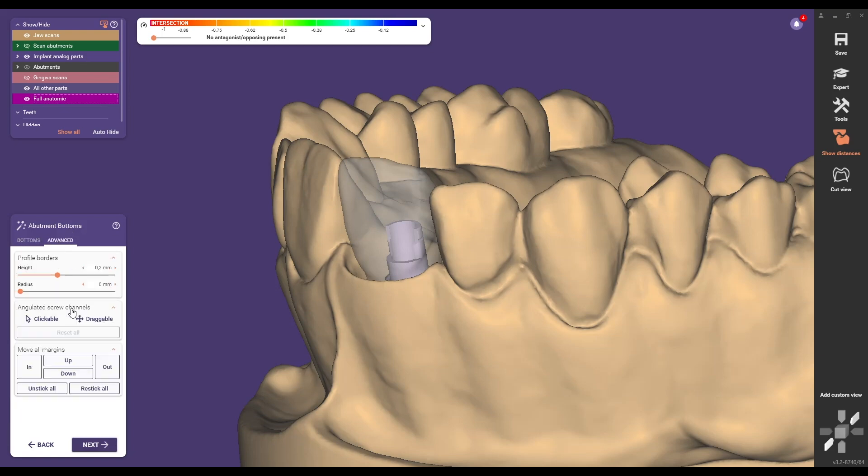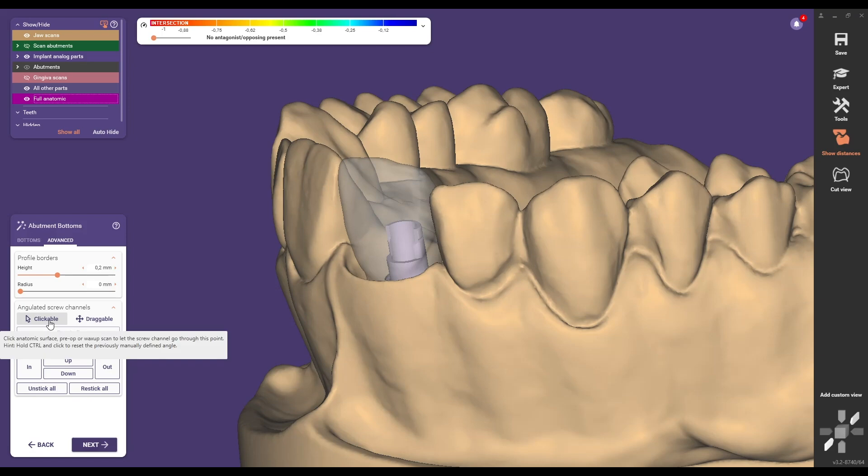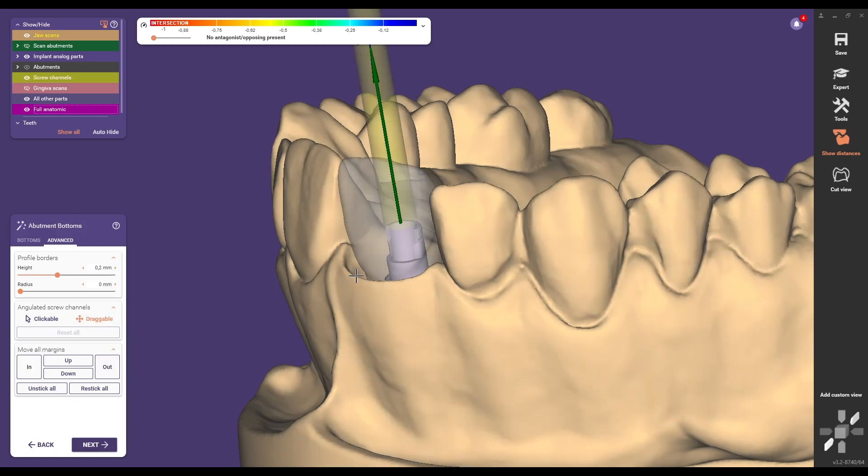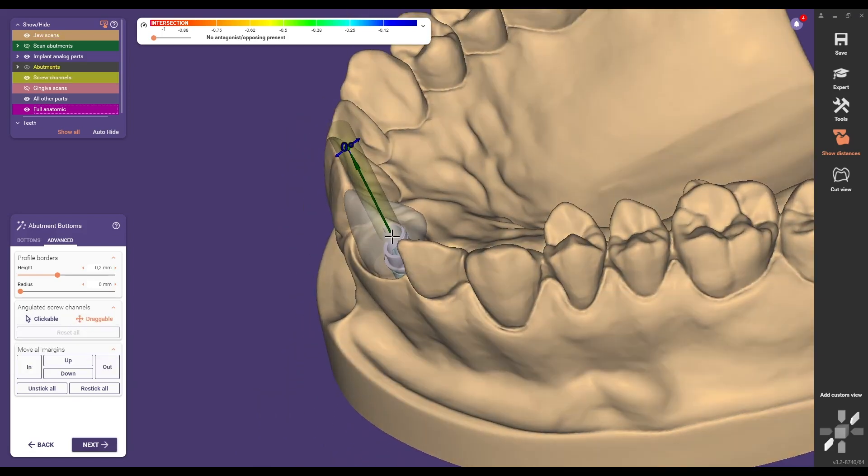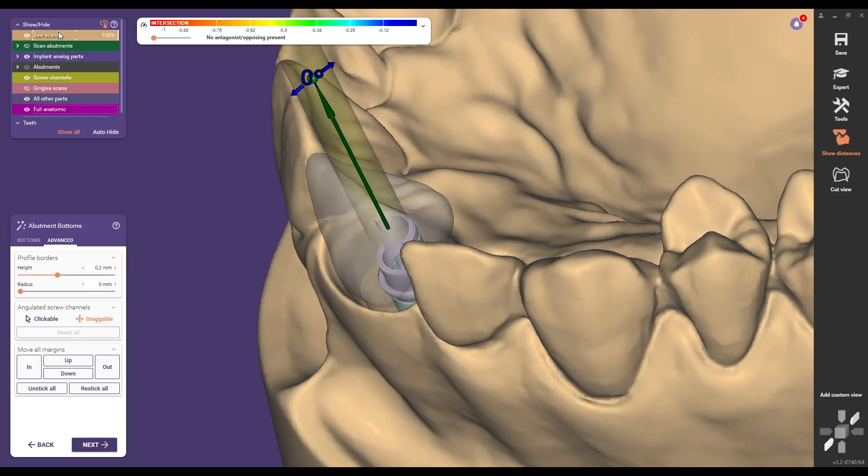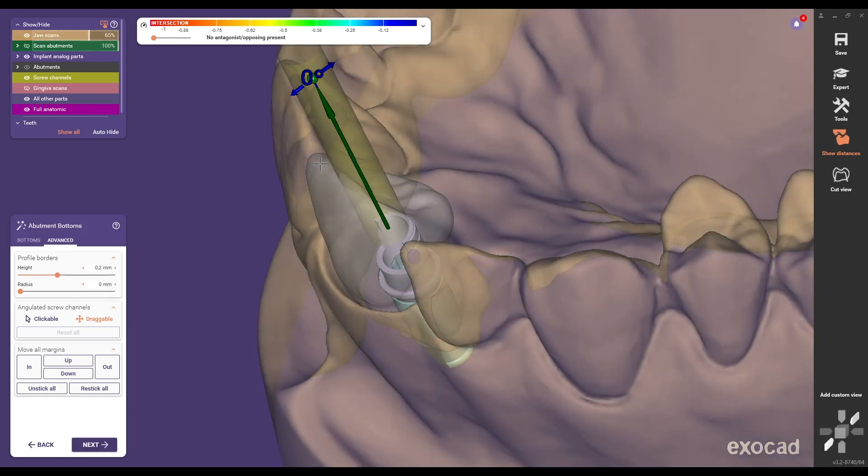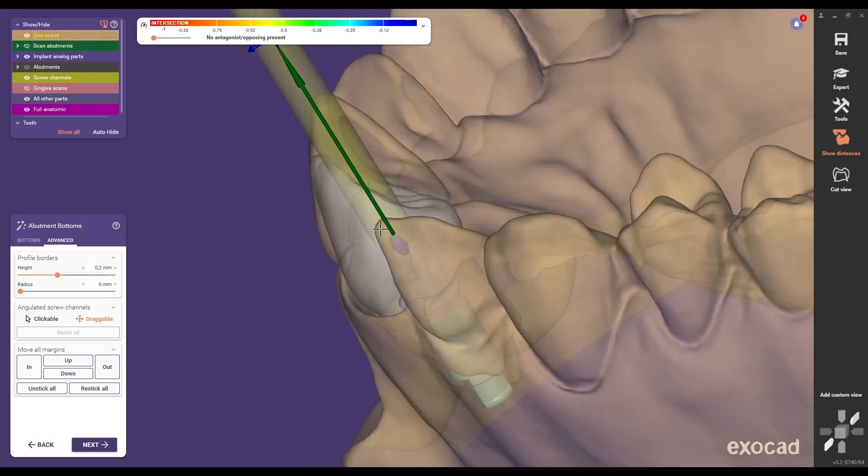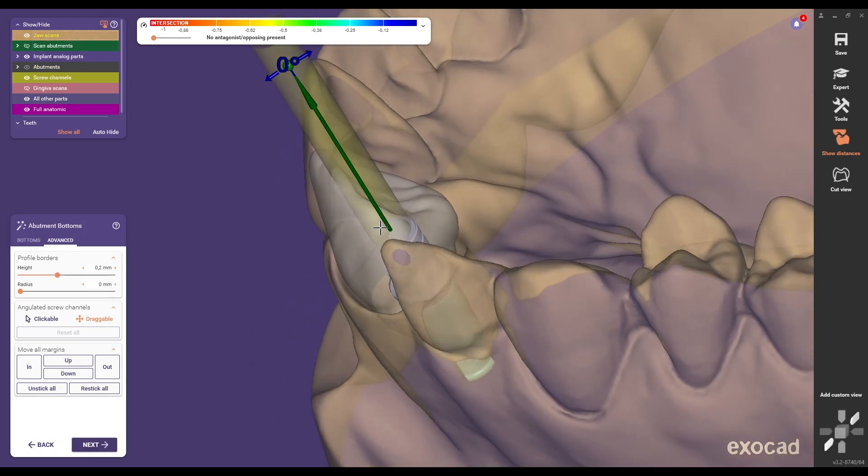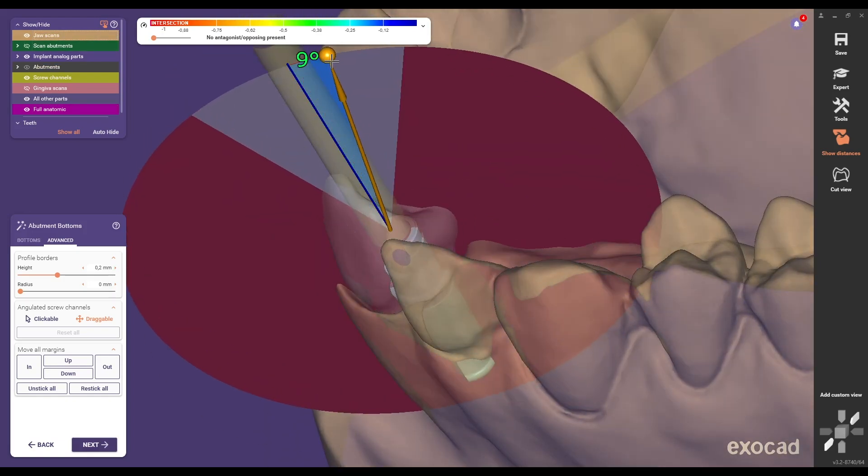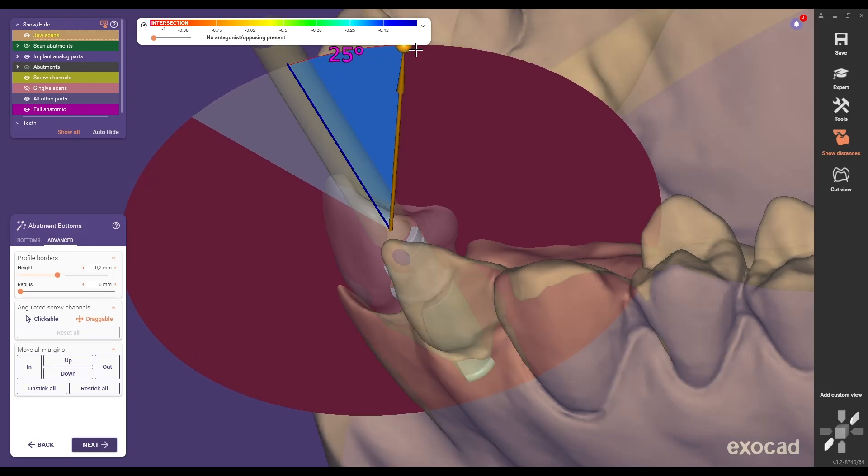Click on the advanced option. Choose the draggable or clickable option to position the angled screw channel as desired. In this example the draggable option is used to position the screw channel palatally by 25 degrees.